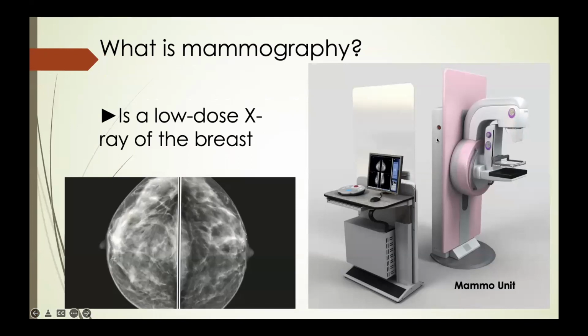Okay, so this is what I was talking about. I was saying that this is how the mammography equipment looks, and this is how the breast looks once the person has undergone the procedure. This is the image of the breast. And I also said that I want to believe and hope that nobody here, if you're less than 40, has had to do this. For those who are 40 years and above, it's now compulsory. I don't know if there's a law in Nigeria, but in some other developed countries, once you are 40 years and above, you have to undergo an annual mammography screening.